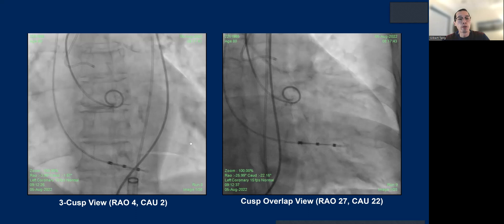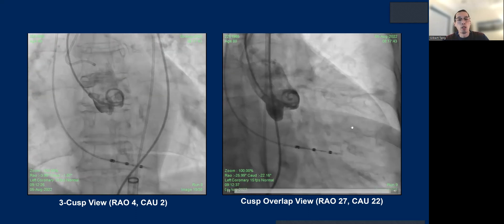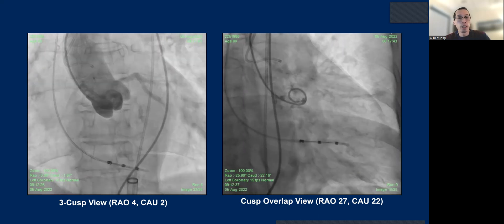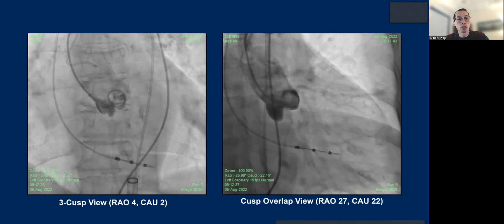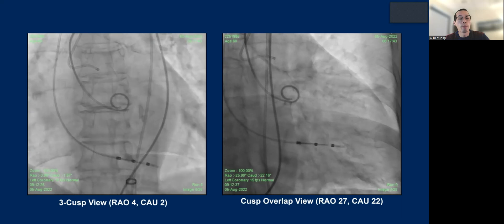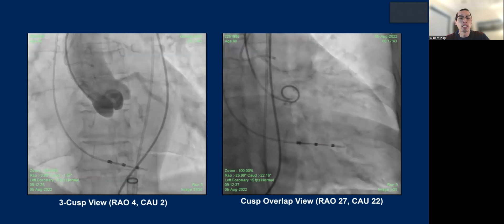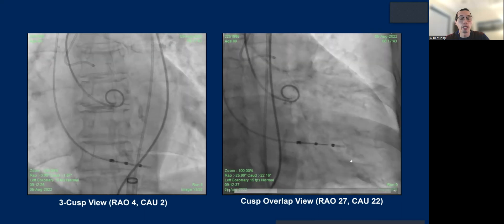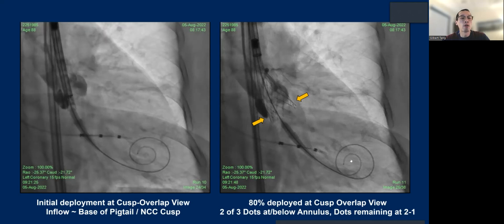This is a three-cusp view and this is a cusp-overlap view. If you don't have a CT to predetermine your C-arm angle, you can do that on fluoroscopy by injecting the pigtail placed in the right cusp. After that, you just superimpose the right and left cusps to generate your cusp-overlap view. It's very quick and requires very minimal contrast.